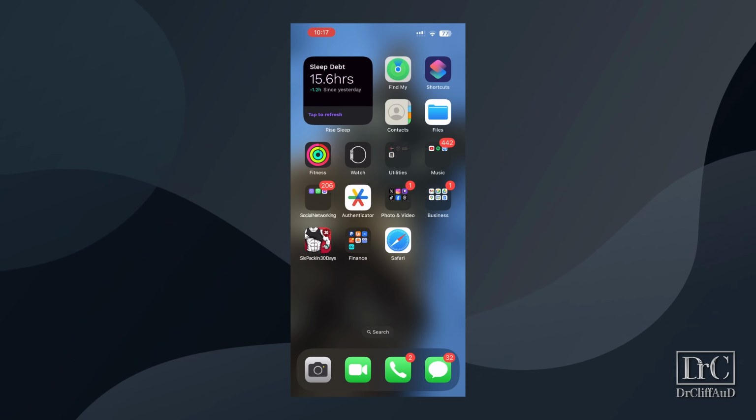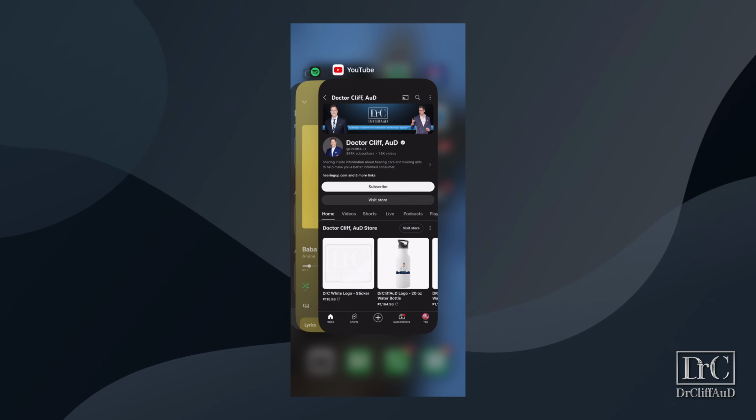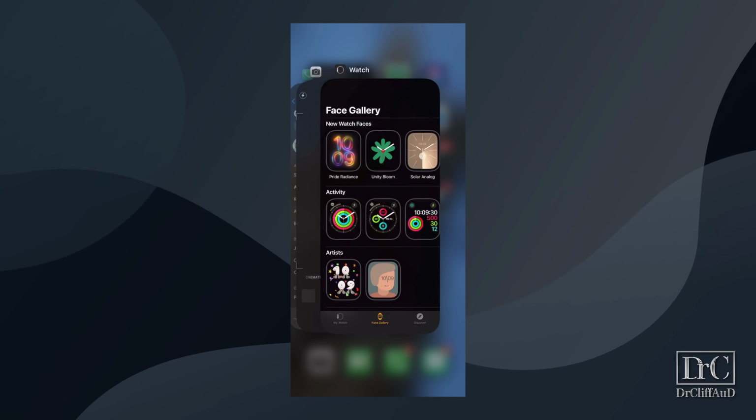Because many of these applications use the same processing power from the phone, it's very easy for one app running in the background to impact the function of a different open app. For this reason, it is recommended that you force quit out of your open applications each night, or better yet, even multiple times each day, to prevent any hiccups in maintaining your Bluetooth connection. On an iPhone, this is done by swiping up halfway and then sliding the app you want to close out of to the top of the screen.